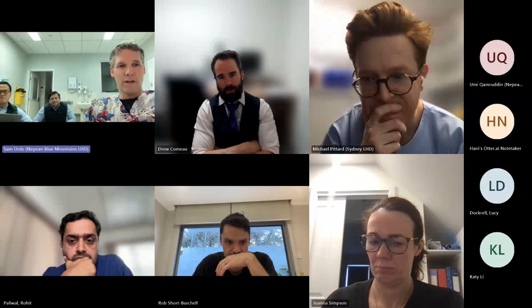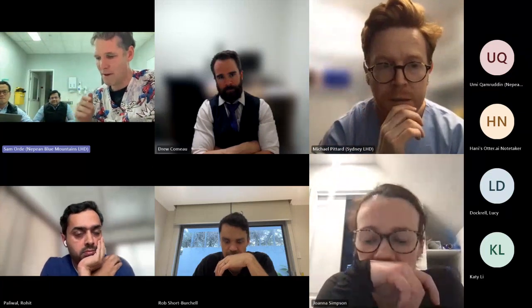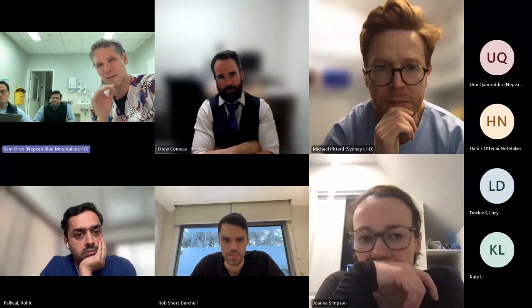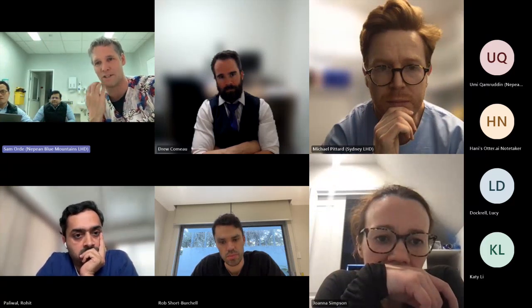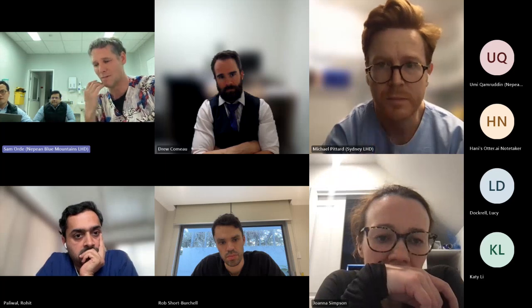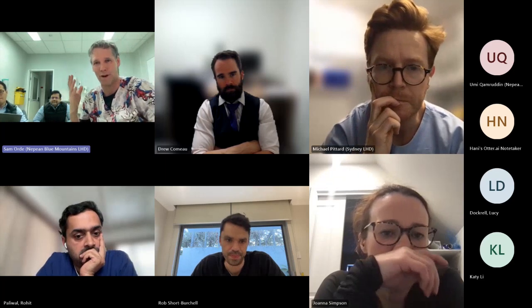Okay. So yeah, excellent, Michael. Really, really nice. A few things to pick up, right? We ask this kind of broad question relatively frequently: we'll show you one picture of mitral regurg and then say, what other views do you want? Just work on a pattern where you can get that out in about 45 seconds.